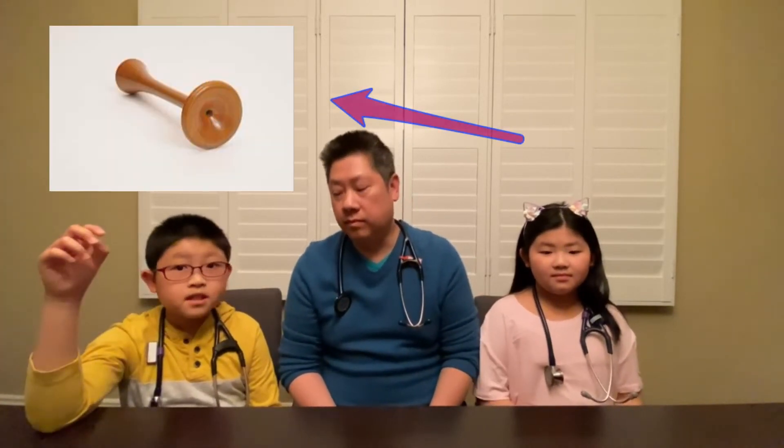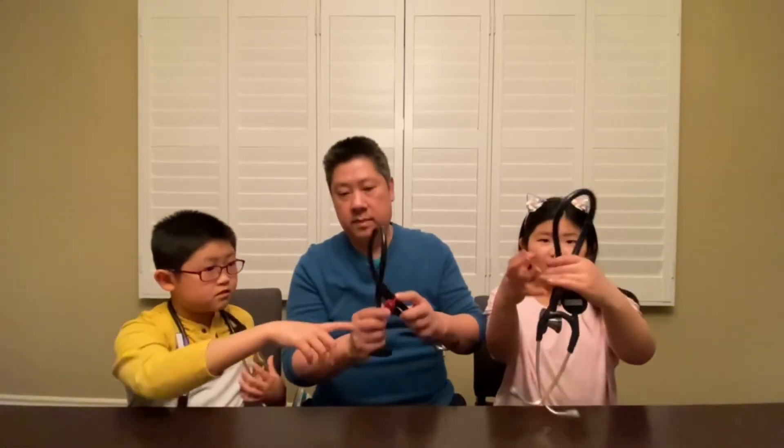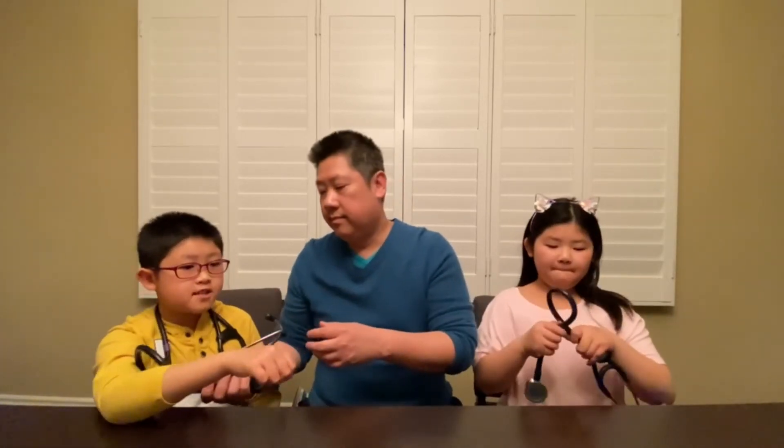The first stethoscopes were made out of wooden tubes. Nowadays they are made out of rubber. Why make it out of rubber? Because when you put it against a person's chest, the wooden one was very cold and sometimes it could hurt. So now we make them out of rubber so it won't hurt.